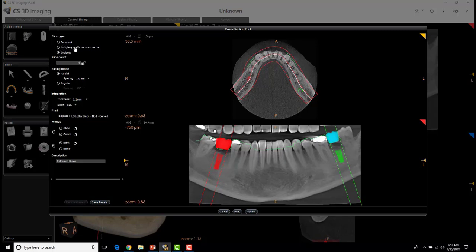There's panoramic, arch, temporal bone cross-section, and implants. It's defaulted to implants because we've got some planned already. You can also see the cross-sectional views in your panoramic view, and the dotted line represents the area in which you're producing those slices and the angle of those slices.